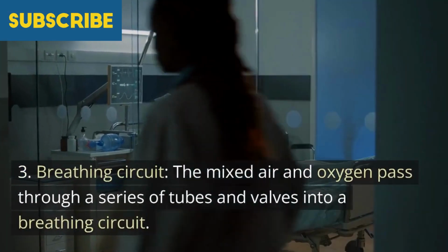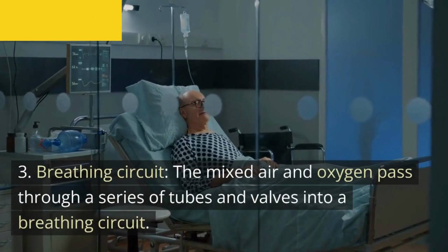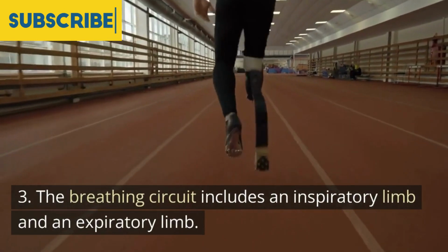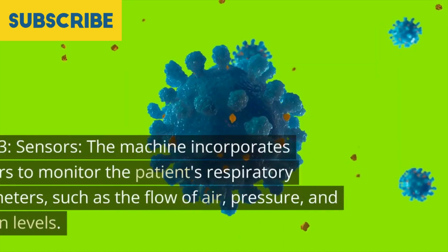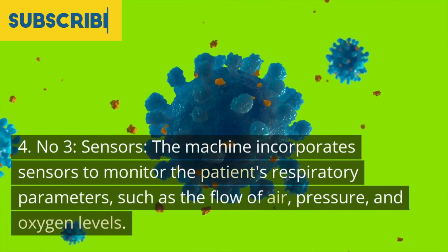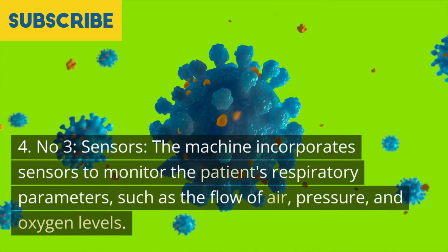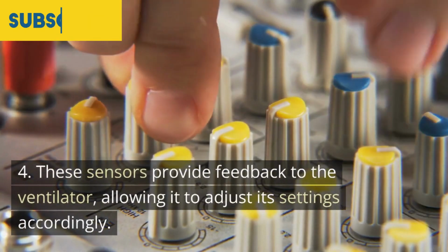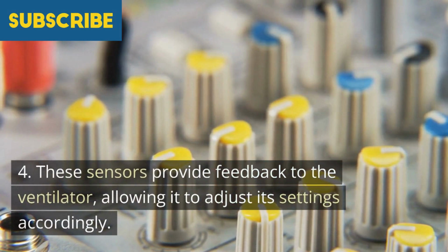Number 3. Breathing circuit. The mixed air and oxygen pass through a series of tubes and valves into a breathing circuit. The breathing circuit includes an inspiratory limb and an expiratory limb. Number 4. Sensors. The machine incorporates sensors to monitor the patient's respiratory parameters, such as the flow of air, pressure, and oxygen levels. These sensors provide feedback to the ventilator, allowing it to adjust its settings accordingly.